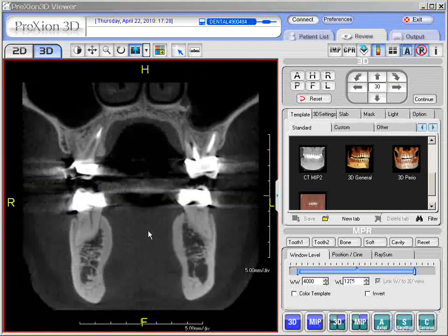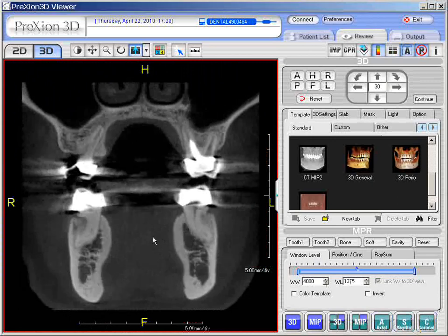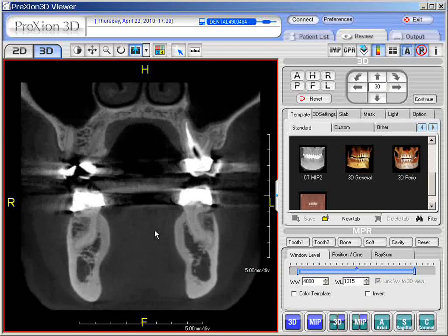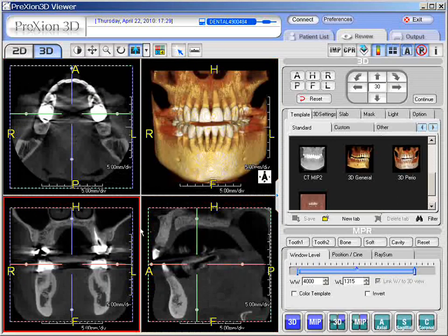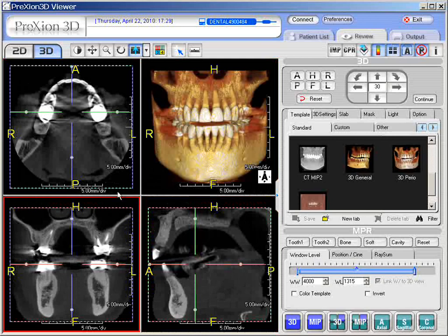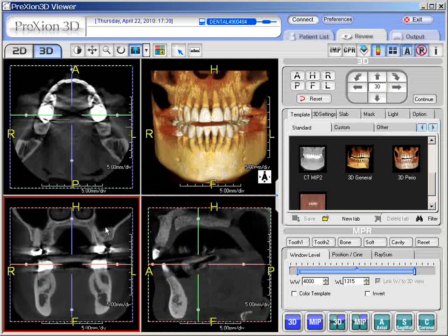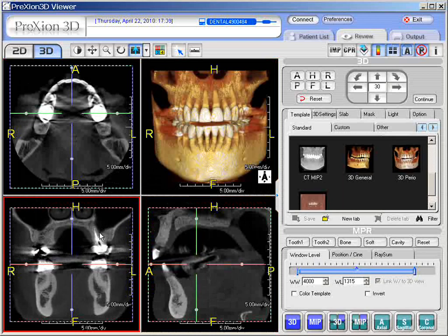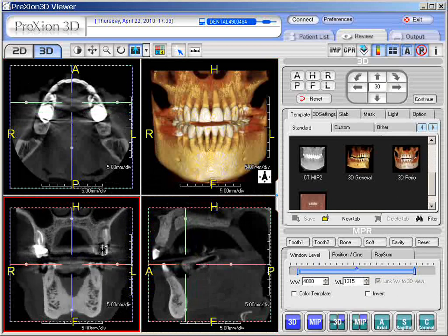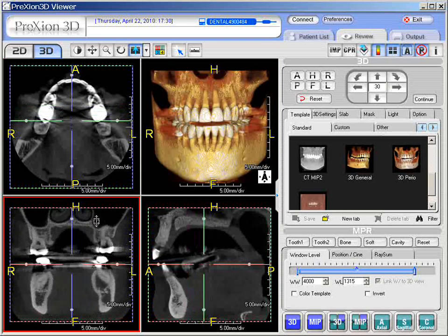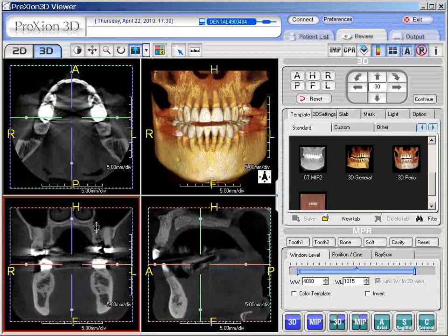There is a fast and a slow way to slice. The slow way is to click the middle wheel on the trackball. If you want to know which direction you're going, double click it and scroll the middle wheel, using the other screens to tell you which direction you are moving. That's the slow method using the middle wheel scrolling. For faster slicing, hold the left click of the mouse and slice through. Alternatively, hold the middle wheel and the right click together — that's another method of quickly slicing through multiple slices.